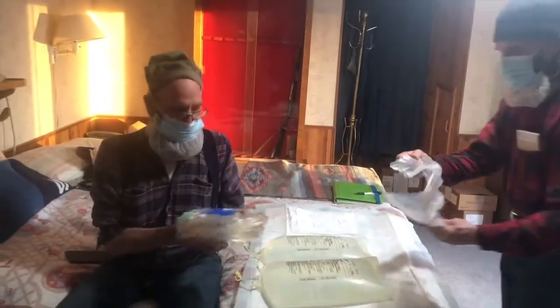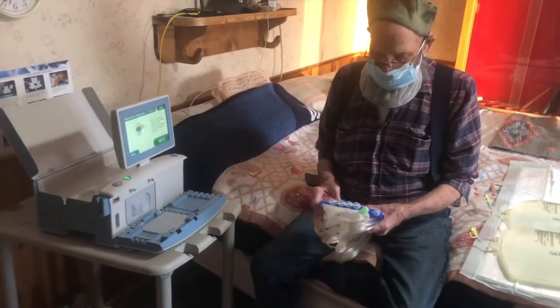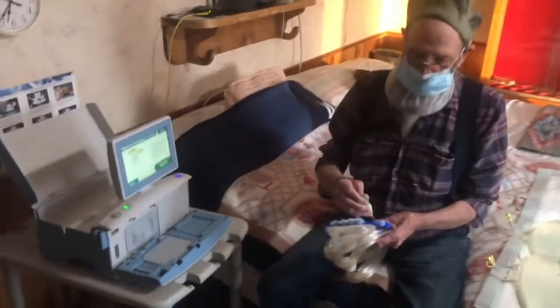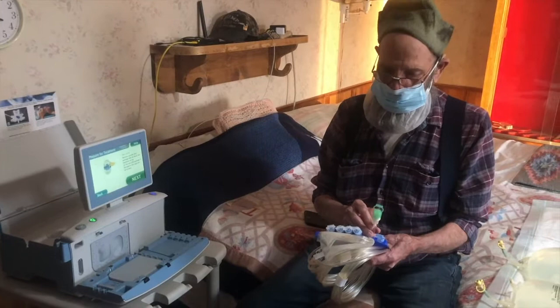Now we get this. Remove the disposable set from its package with the blue line organizer on top. Do not use if the package is damaged. Make sure that all caps are on. This one here is the only one that just has a cap that slips on. So this is your lifeline here. This is the one you want to be really careful with. You don't want to get any contamination on this one.